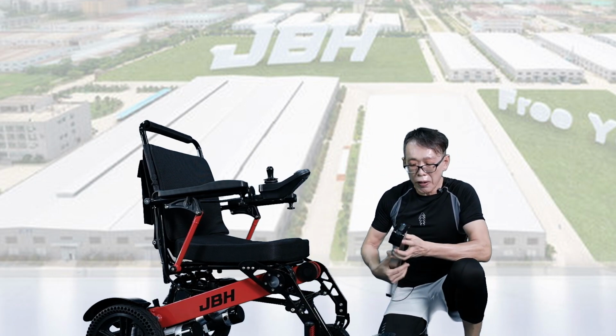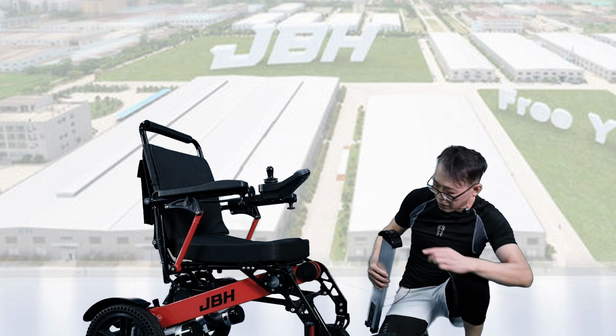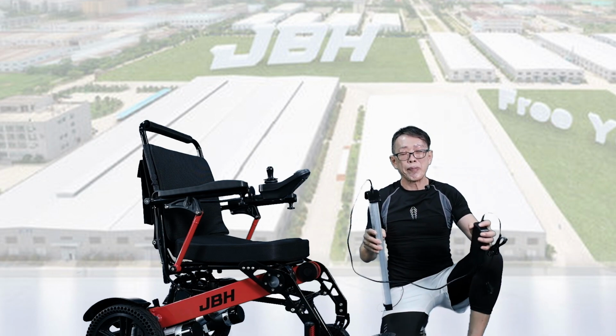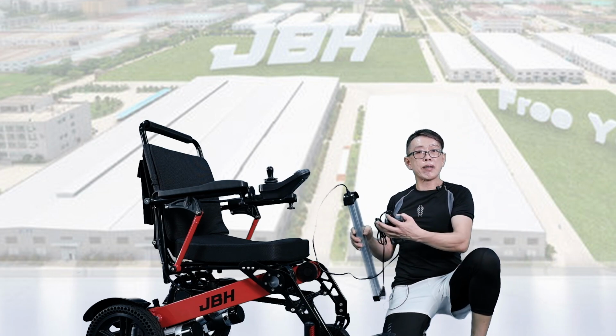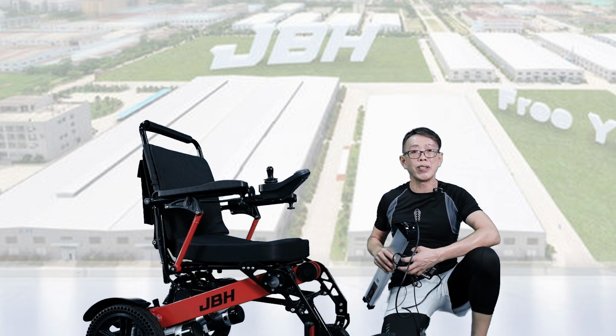Right at the front end of the battery, you can find a charging port here. You simply plug in the charger, and then you can take out the battery right inside your home, or you can take out the battery to any other location wherever there is a power source for charging.